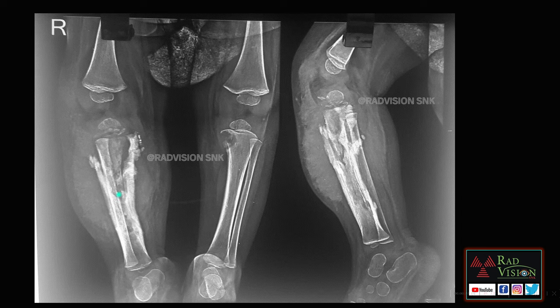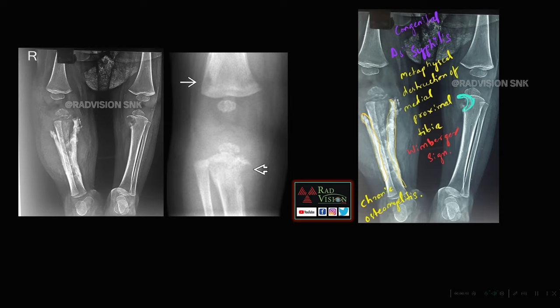You can see there is metaphyseal destruction on the medial aspect of the proximal tibia. Whenever you see this typical metaphyseal destruction on the medial aspect of the proximal tibia along with chronic osteomyelitis, one of the differentials you should suspect is congenital syphilis — especially if the patient is a child with a long-standing history. This is the metaphyseal destruction on the medial proximal tibia along with chronic osteomyelitis.